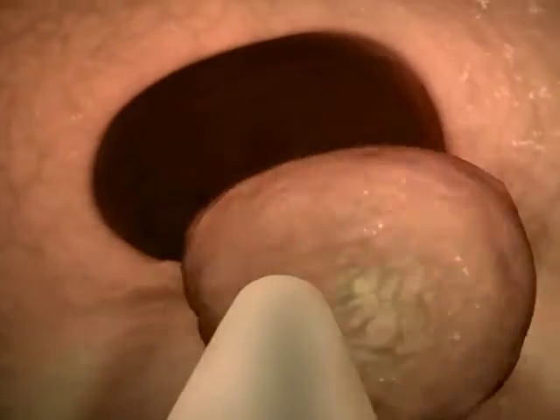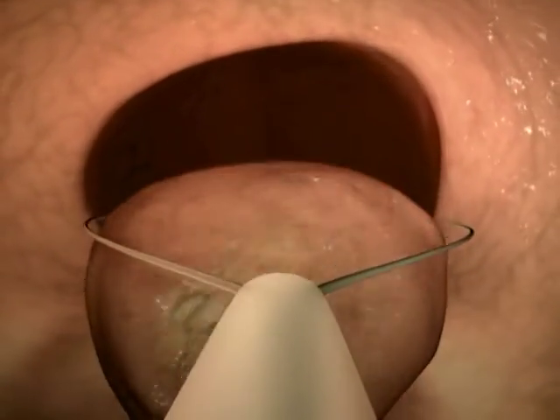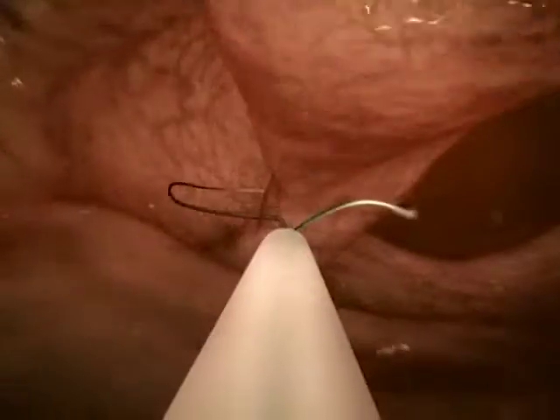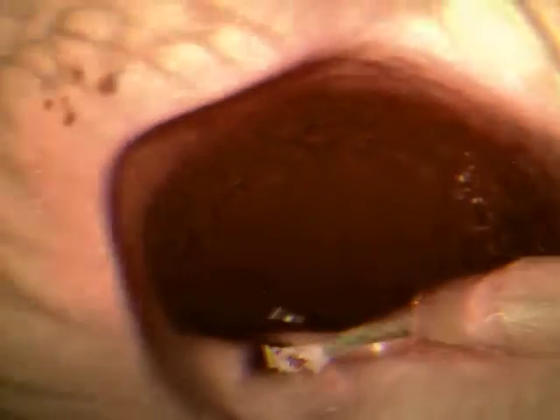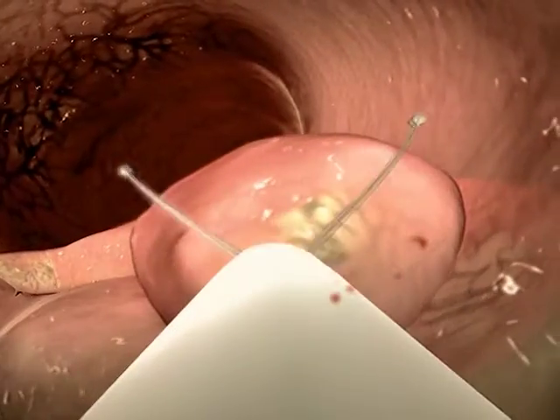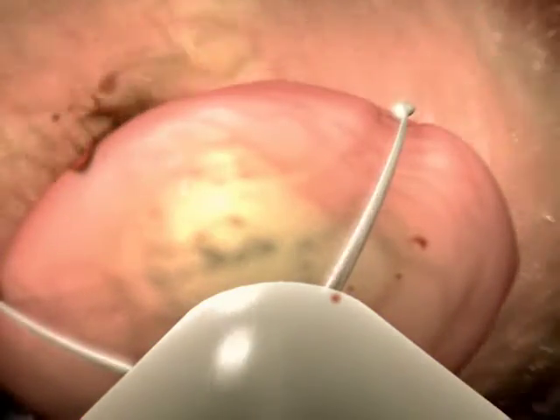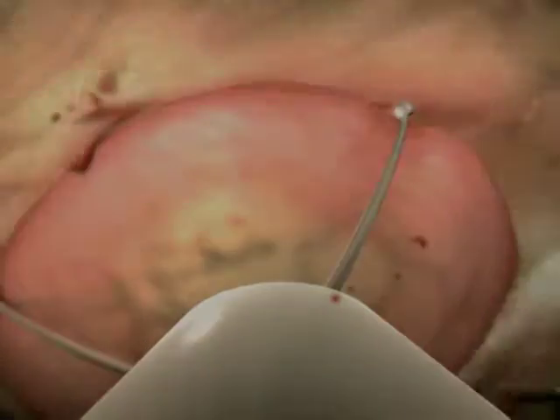The method of removal often depends on the anatomy of the polyp. Pedunculated polyps lie proud of the bowel wall on a stalk, and a snare can usually be passed down the colonoscope and positioned around the stalk. A small electric current flows through the snare to sever the polyp near to its base, and a range of techniques can be used to retrieve the polyp for further microscopic examination.